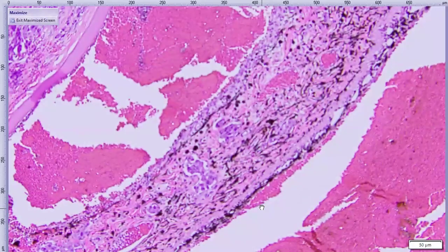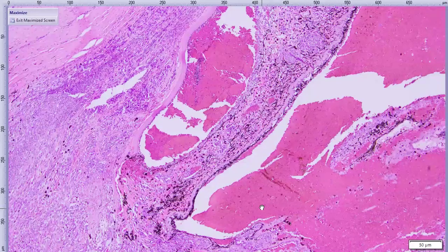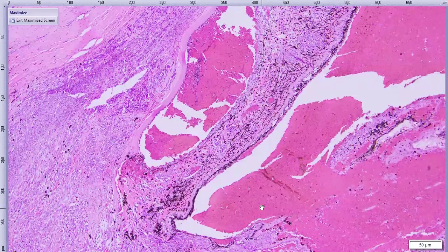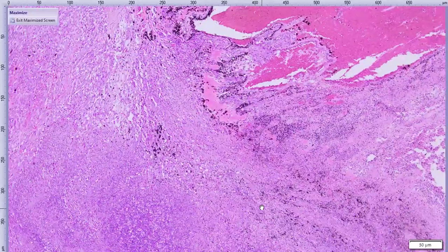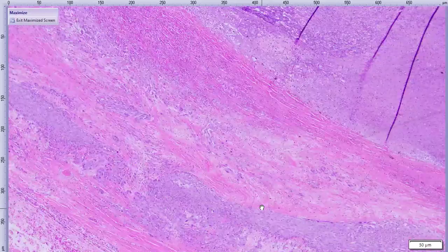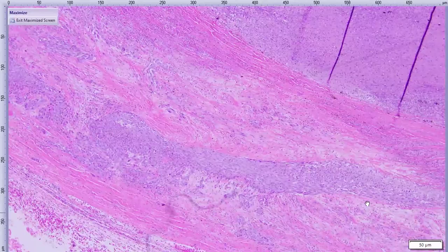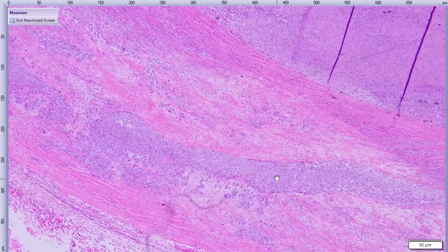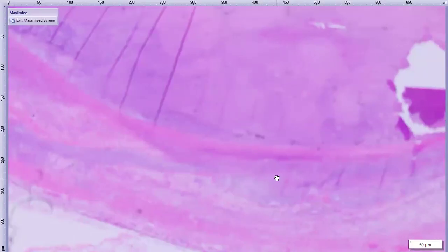whether we think these cells arrived in the eye from elsewhere in the body, so they're arriving in these blood vessels, versus developing in the eye and exiting the eye in the blood vessels. Honestly, in this case, I think it's both. And part of the history that I didn't share with you is good evidence of that. So as we move out into the sclera, I think this is probably a big vessel that's chock full of cells. The other side of the sclera is a little bit more convincing, so I'll show you that in a moment. Let's just move back for a sec.